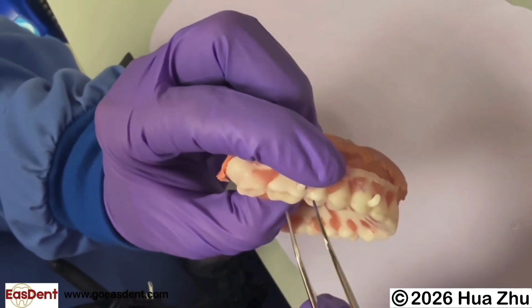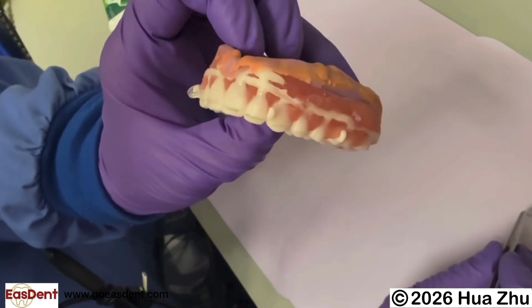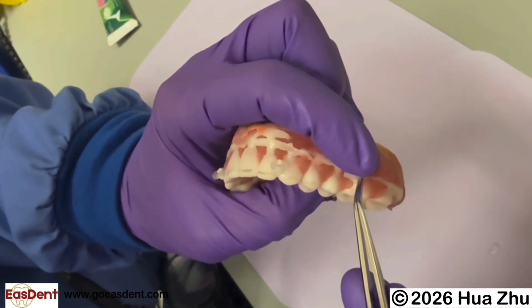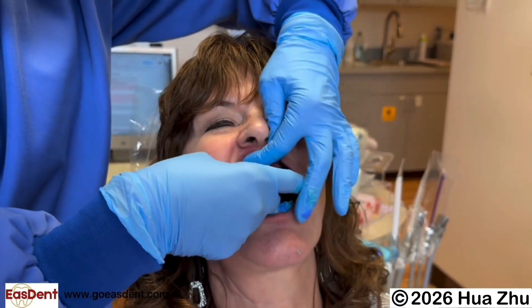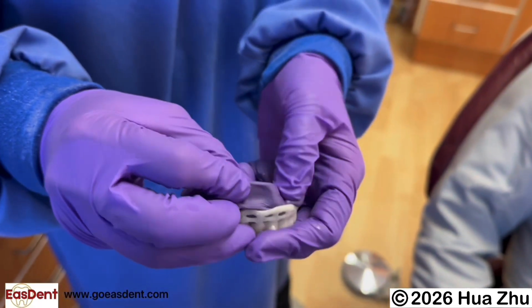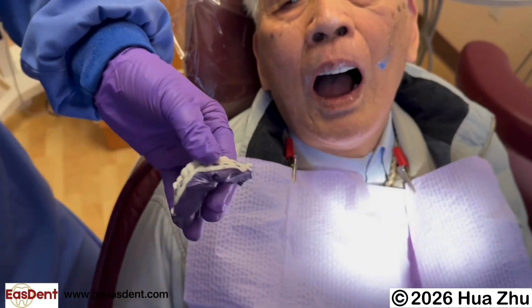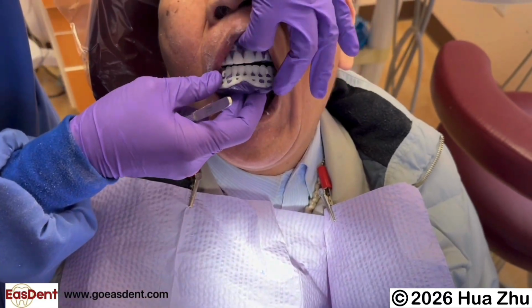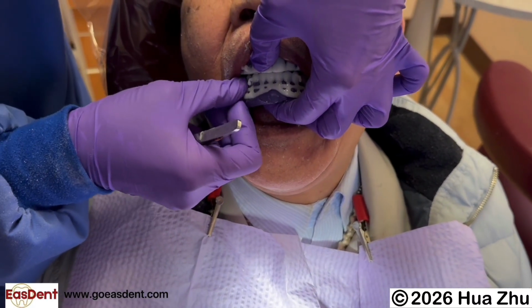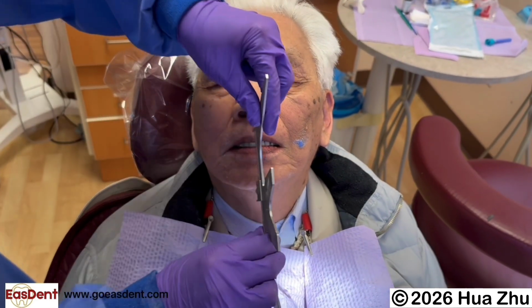If the patient cannot open wide enough to fit both trays in simultaneously, leave the elastomers on the hooks of the maxillary Easdent impression and seat the maxillary impression in the mouth. Then add the moldable material to the tissue side of the mandibular tray and insert the tray into the mouth. Hook the 4 elastomers from the maxillary Easdent impression onto the hooks of the mandibular Easdent tray. This will free your hands to record centric relation and VDO. Guide the patient to bite at the centric relation slowly into the preset starting VDO using a tongue blade or Easdent measure as a guide.